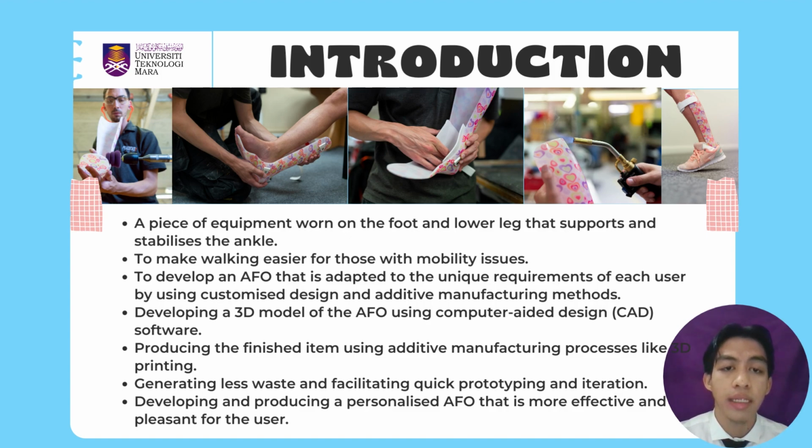Complex, personalized products may be made with high accuracy and precision with additive manufacturing. It also has the benefit of generating less waste and facilitating quick prototyping and iteration. Developing and producing a personalized AFO that is more effective and pleasant for the user could be feasible.